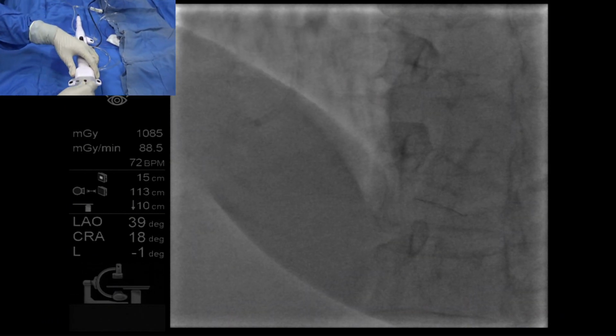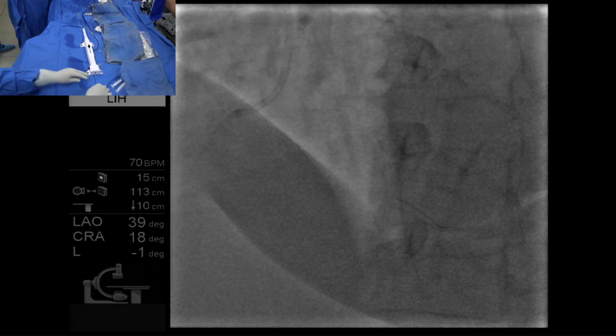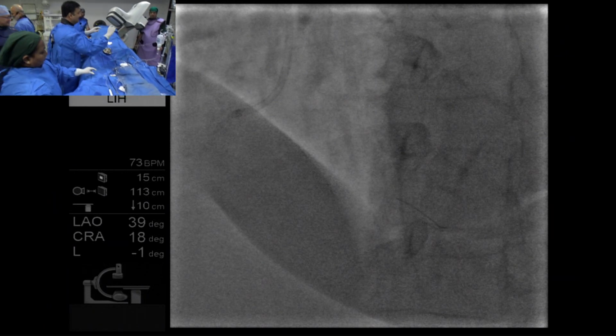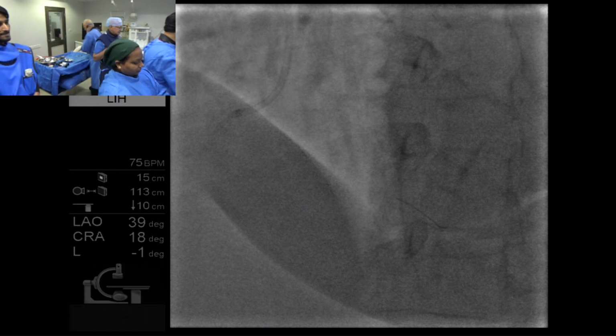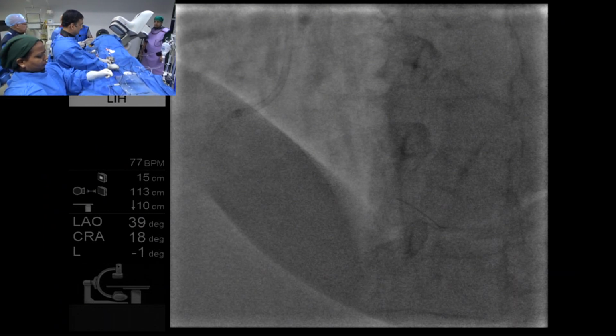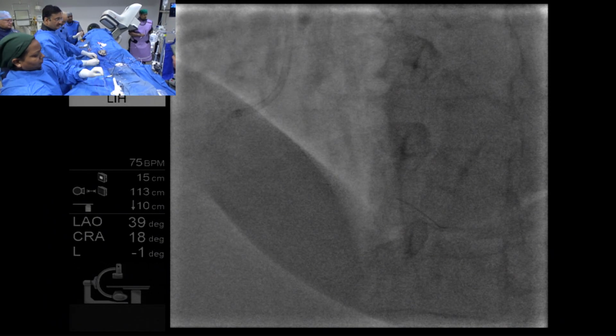So again, there was a little bit more bradycardia there, but it was made up by all the extra heartbeats here in the room. This rota has made at least our job easy for the distal lesion, about which I was worrying more. Microcatheter. Microcatheter.